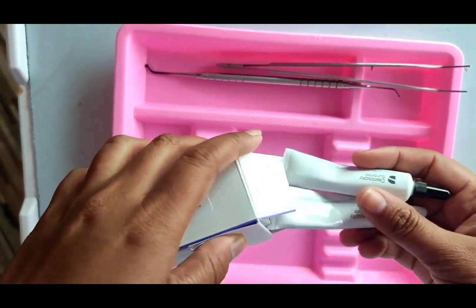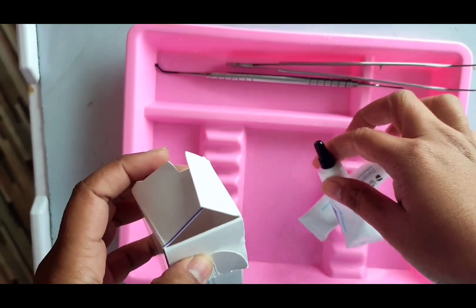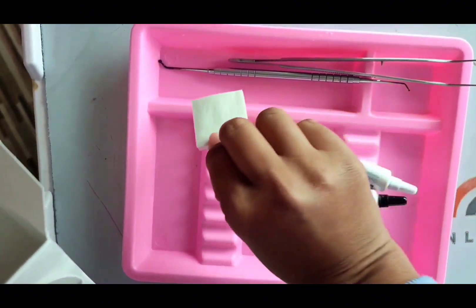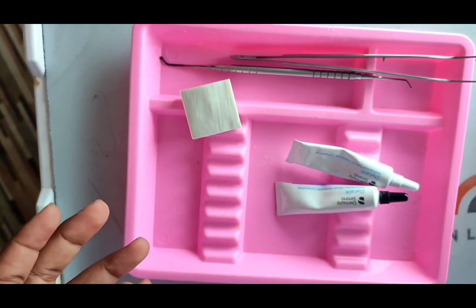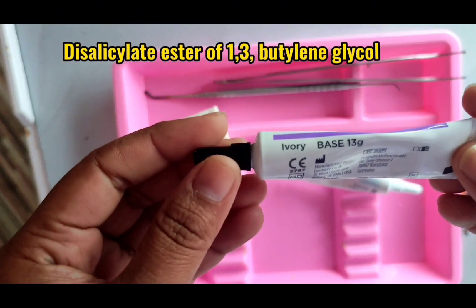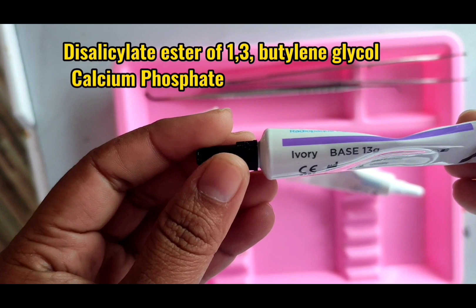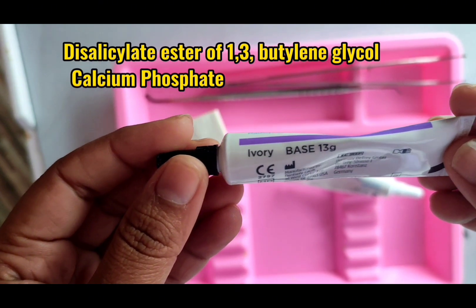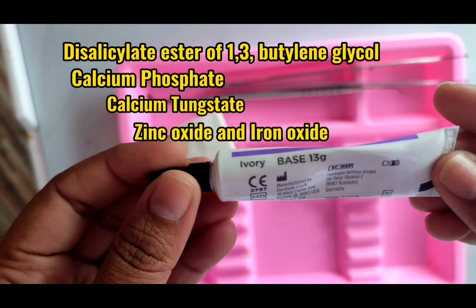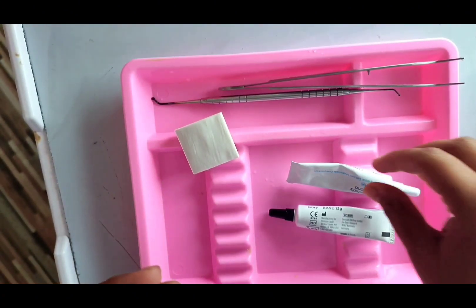Dycal comes with two tubes — one is the base and another is the catalyst — and a parchment paper pad. The base paste is composed of disalicylate ester of 1,3-butylene glycol, calcium phosphate, calcium tungstate, zinc oxide, and iron oxide.